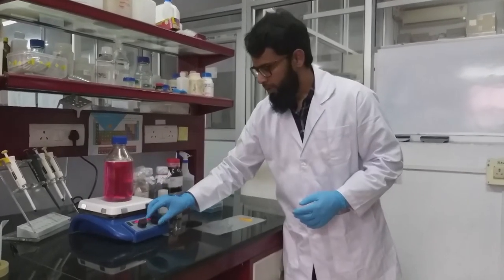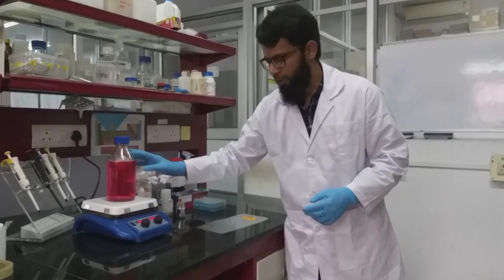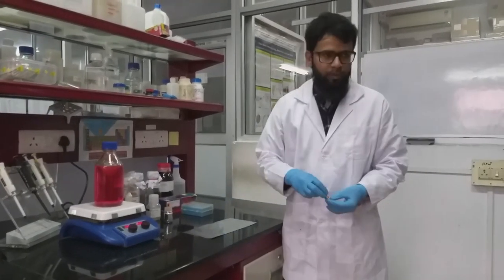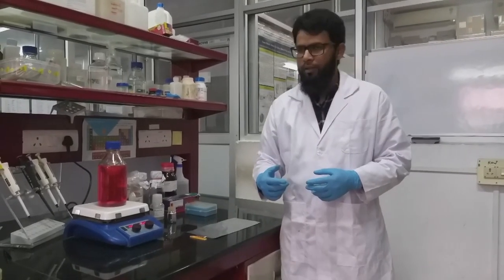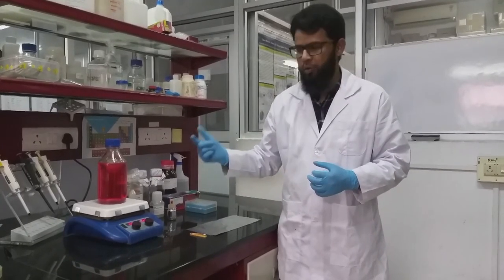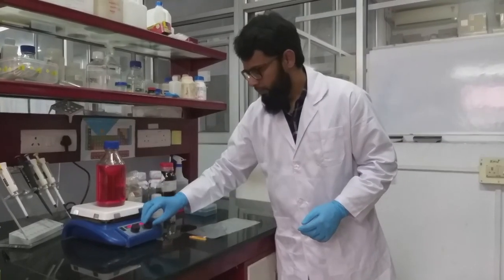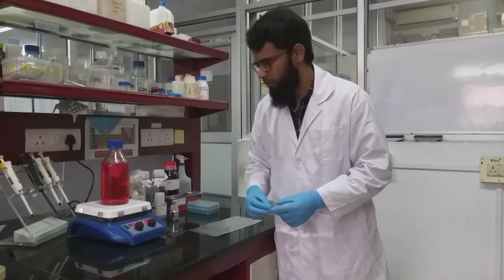After the media components have dissolved completely, we need to set the pH of the media. For that purpose, either we can use a pH meter or pH strips. In this case, we cannot use a pH meter, as the bulb of the pH meter is sensitive to the media components and may get corroded.